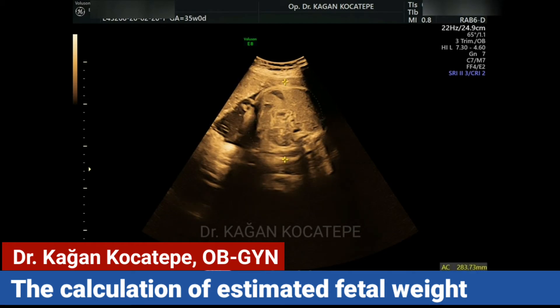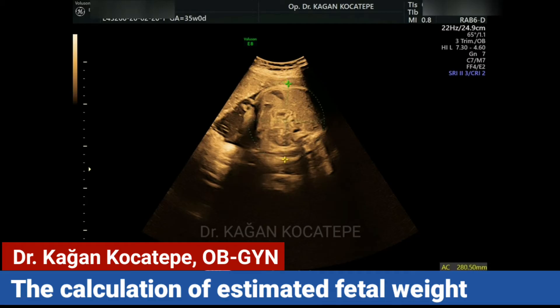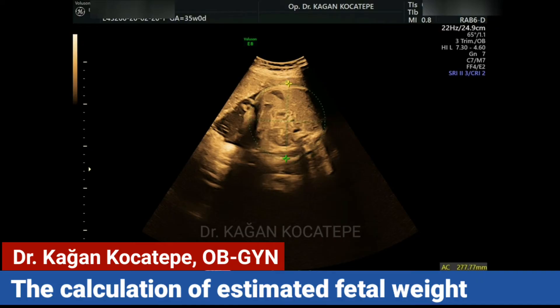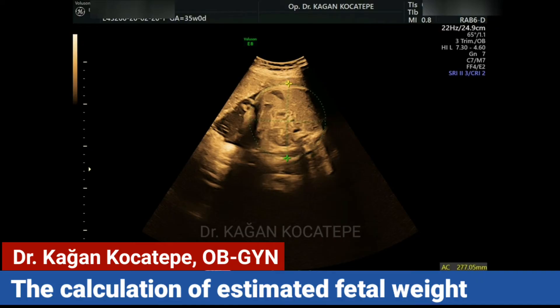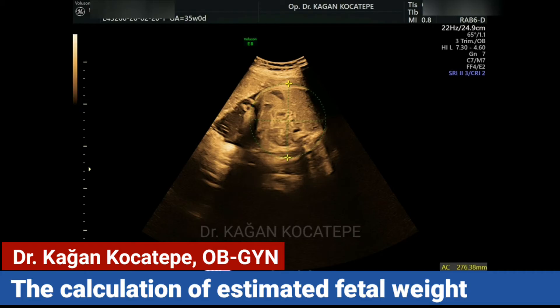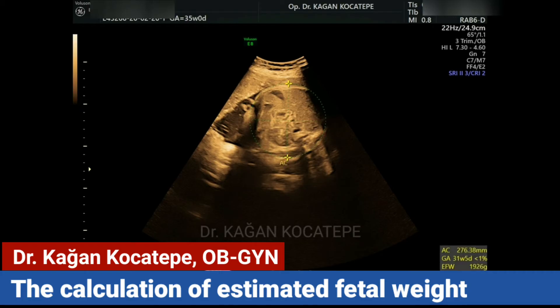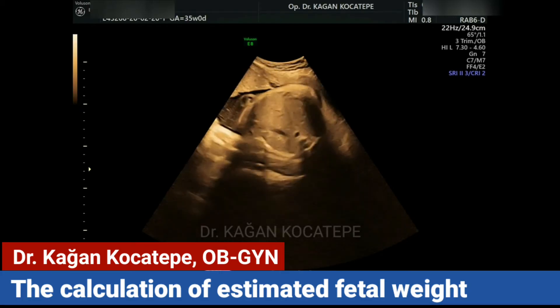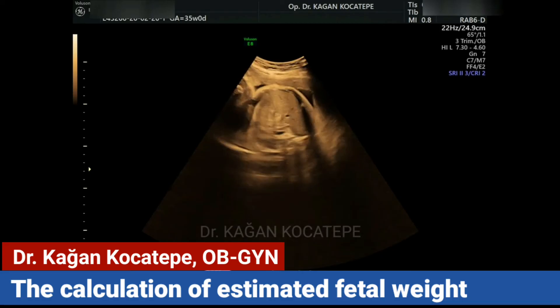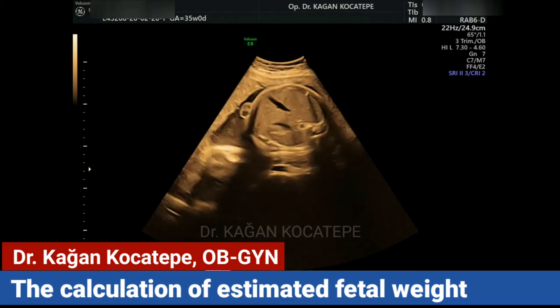In order to measure the AC correctly, the image must be round shaped, and the stomach and the umbilical vein must be seen in the image.